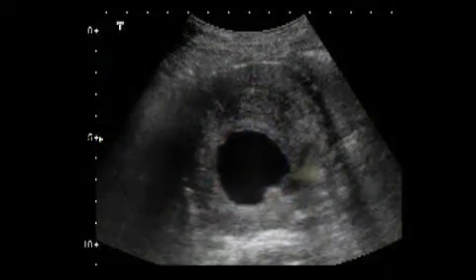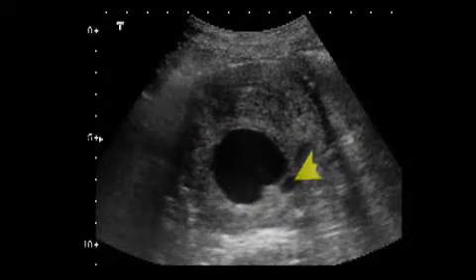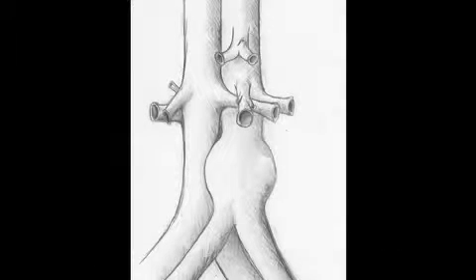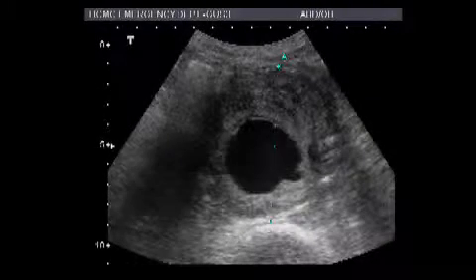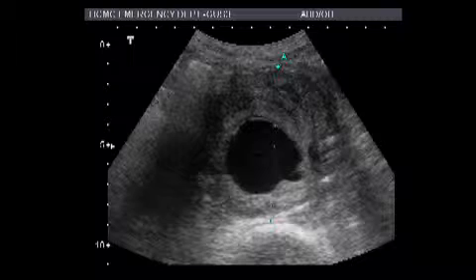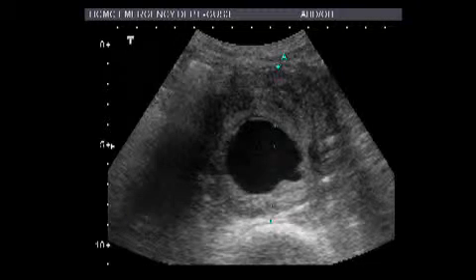This view demonstrates a rupture of the left posterolateral wall of the aorta, which is the most common site of rupture in a AAA. Once detected, attempts should be made to document the location and extent of the AAA in relation to the major vessels. Be sure to include the entire diameter of the aneurysm, which includes both the thrombus and the echo-free lumen in your measurements. The most common mistake in measuring AAA is to include only the echo-free lumen.